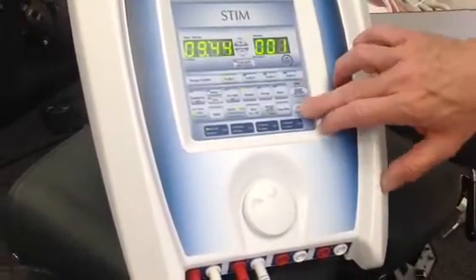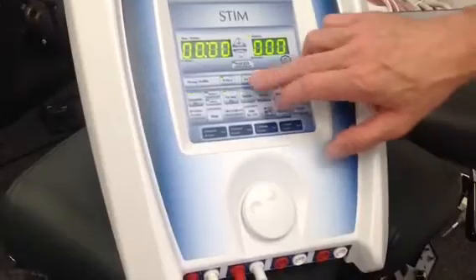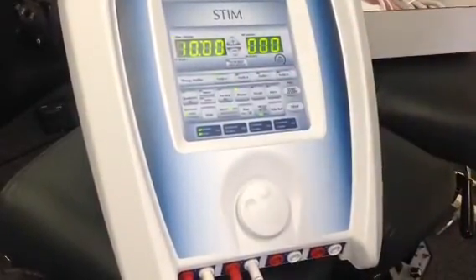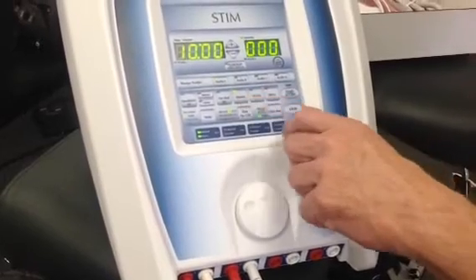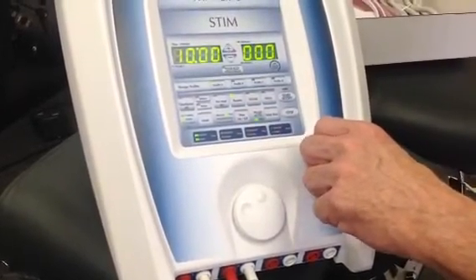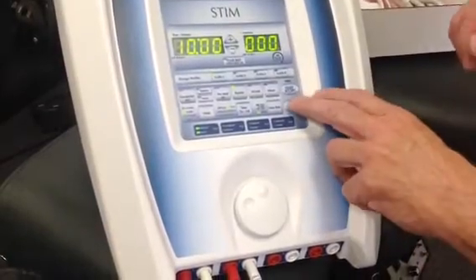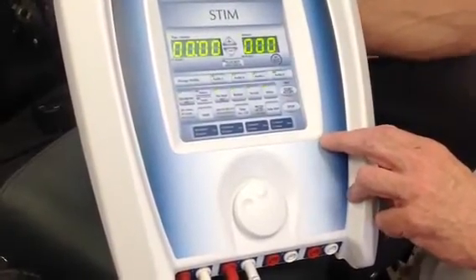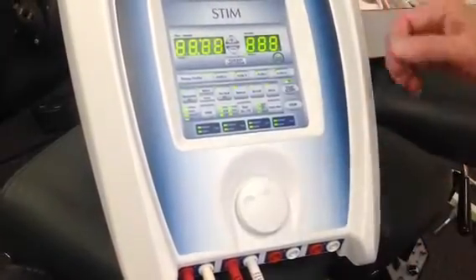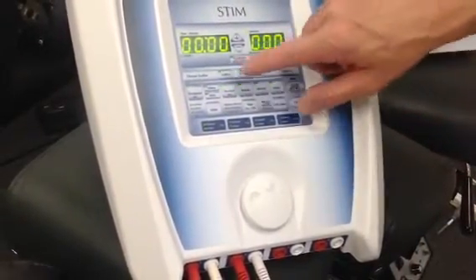Now, when I hit stop and I go to Profile A, which we just set, it is just like what we set: Russian stim, 10 seconds on, 10 seconds off, and we're ready to go. So what I'm going to do is reprogram it, do this again, and change it back to quadripolar.